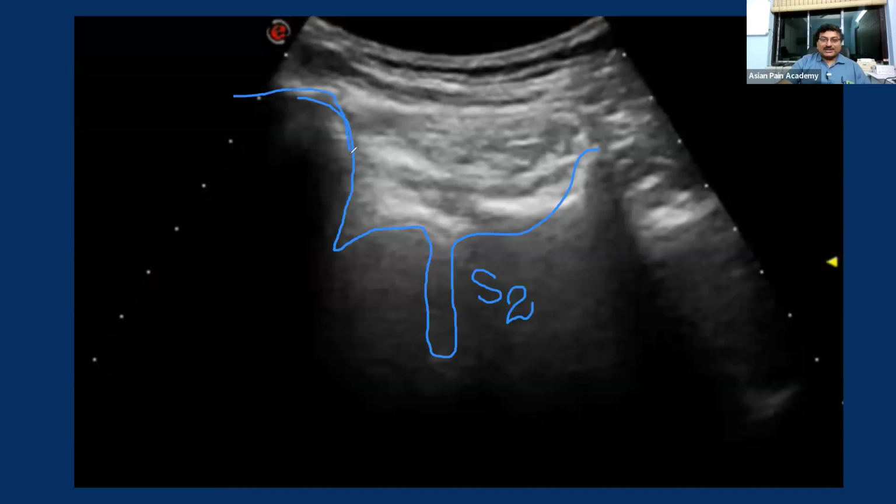Though by looking at this high peak, it might appear to be the posterior superior iliac spine, but usually the posterior superior iliac spine does not fall at the level of the S2. It is not here. You can see clearly echoes are moving in. So it is the S2 foramina. It is the sacroiliac joint, and it is slightly below the posterior superior iliac spine.